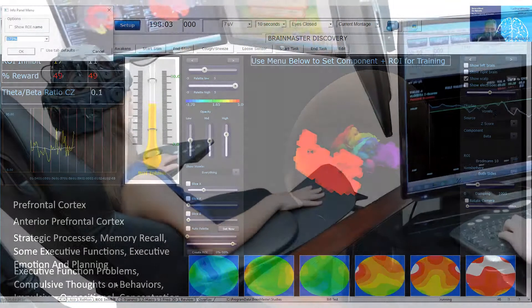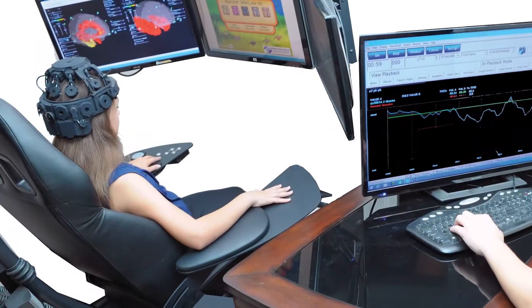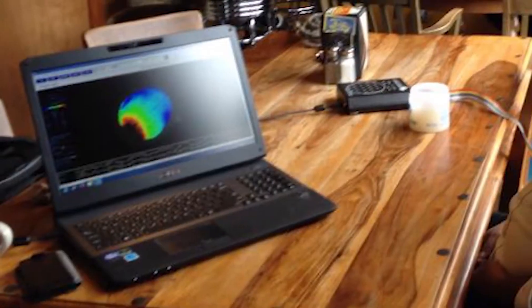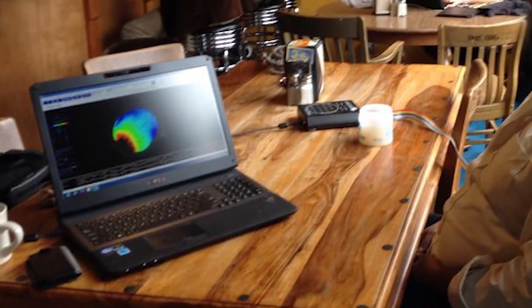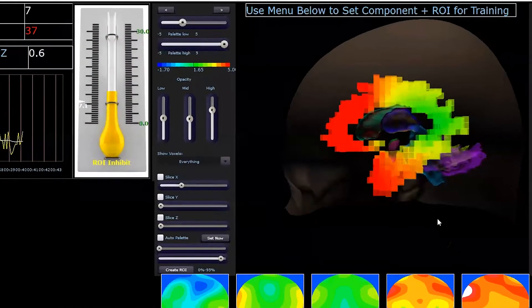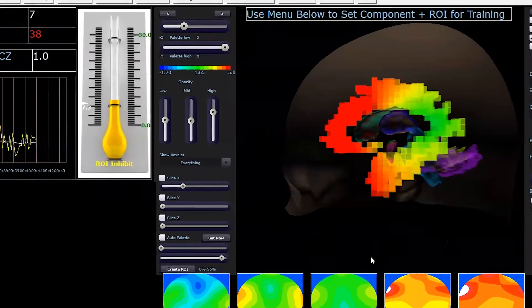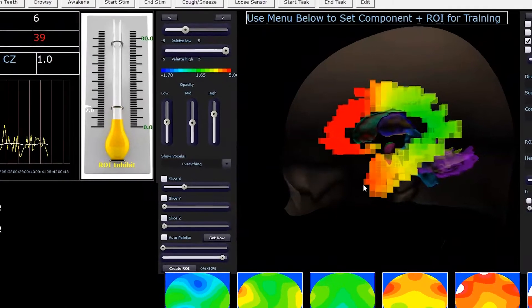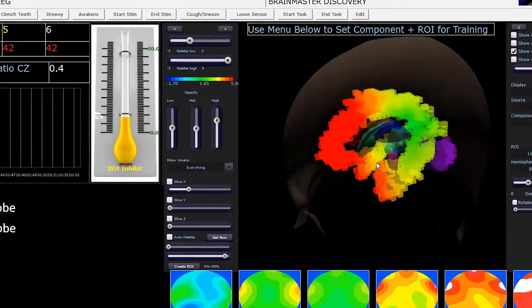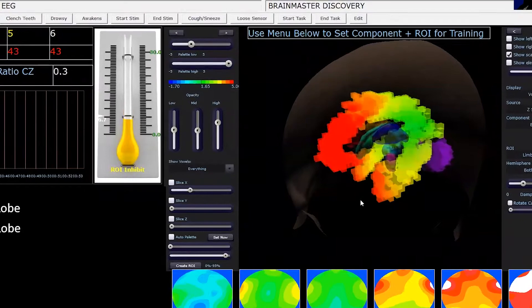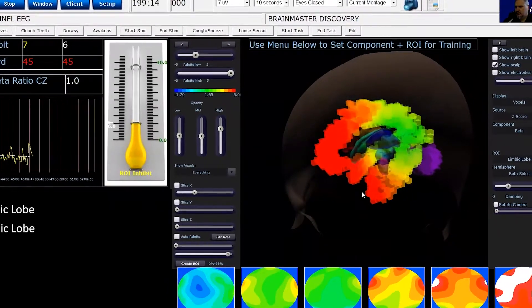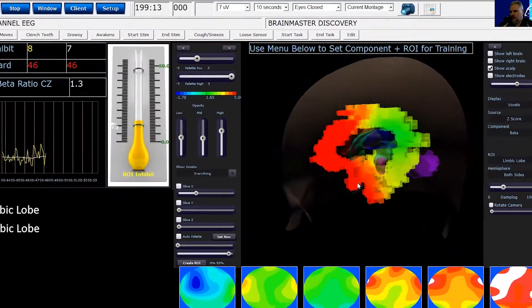Brain Master Technologies, a leader in clinical EEG, 3D brain imaging, neurofeedback and biofeedback systems, is pleased to offer Brain Avatar — the gold standard. A clinical EEG software suite of products providing therapeutic and assessment tools utilizing comprehensive and customizable protocols.